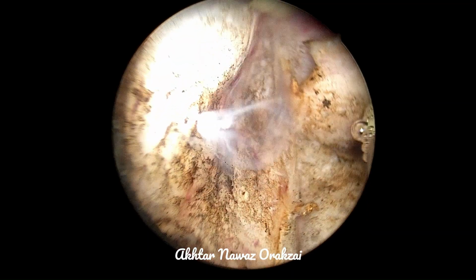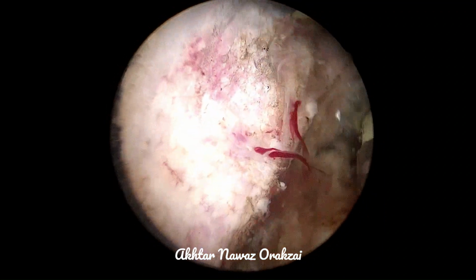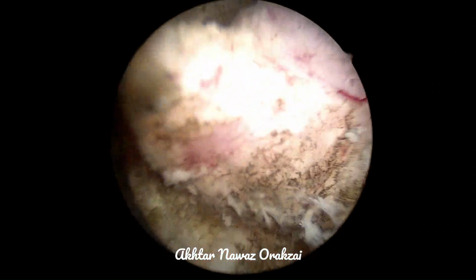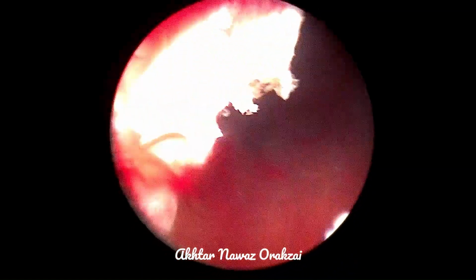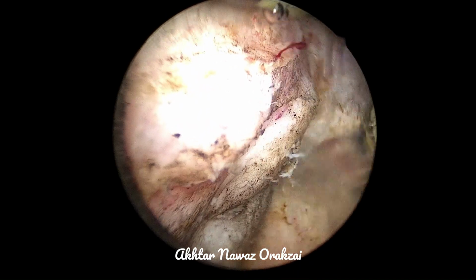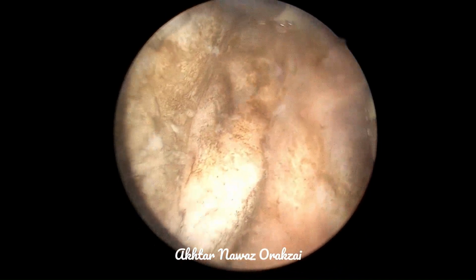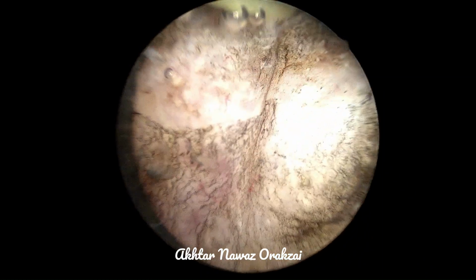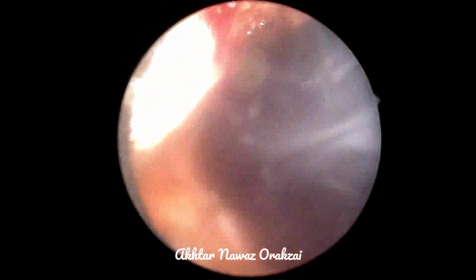After resecting and flattening the median lobe, we resect the left lateral lobe and then complete the resection towards the 1 o'clock position. Then we start resecting the 7 to 9 to 10 o'clock position or even the 11 o'clock position. So we resect this area.